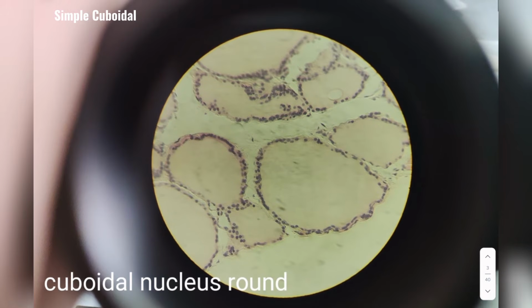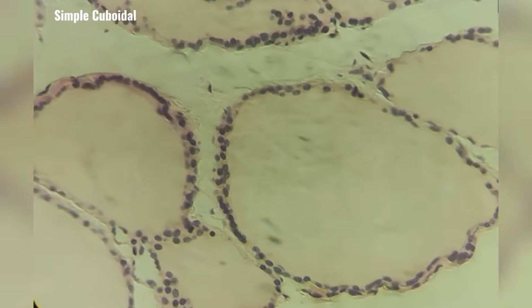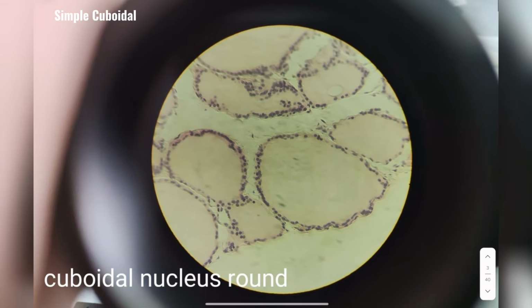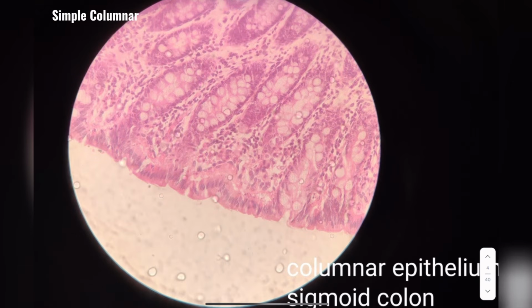Second, you can see these follicles. Surrounding these follicles are cells, and these cells contain round nucleus, arranged in a single layer. So this is obviously simple cuboidal epithelium. Okay, so we are done with simple squamous with flat nucleus, simple cuboidal with round nucleus.